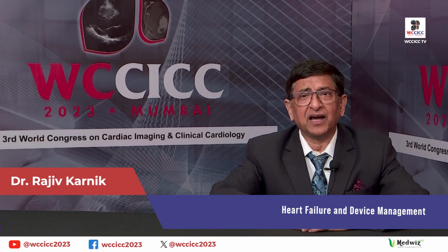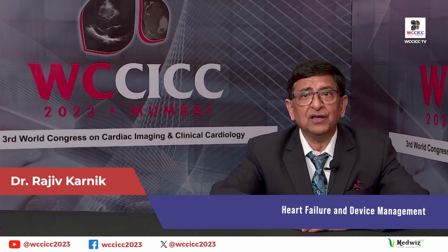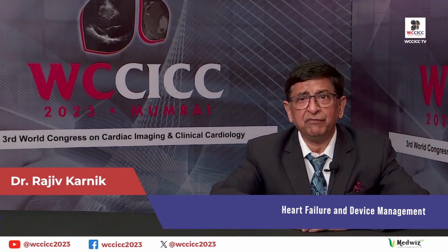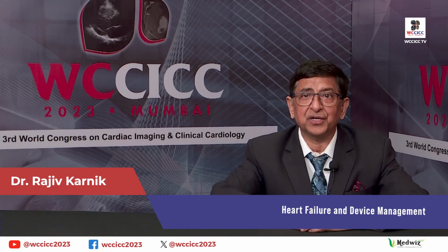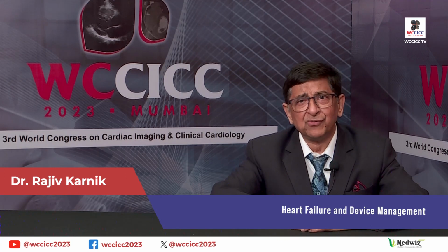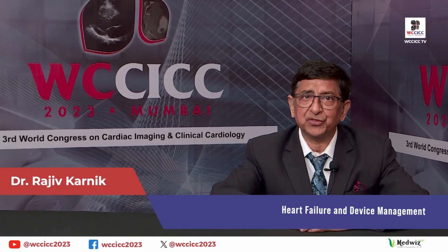So by putting another device, what is called the MitraClip, you can clip the mitral valve with the help of catheter-based treatment, and then you can reduce this mitral regurgitation. This was proved very well in what is called the COAPT trial. And then subsequently in 2023, at the American College of Cardiology, or ACC 2023, with the World Congress of Cardiology, further extended results of this COAPT trial were shown. This MitraClip works very well. Apart from that, there are various other devices also, but then they are still equipoised results, so I will not deal with them much.